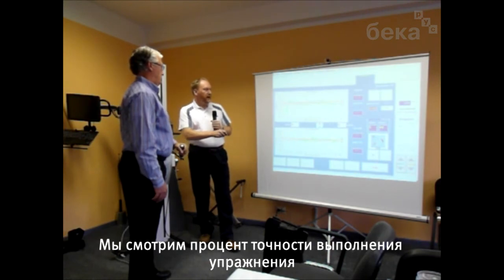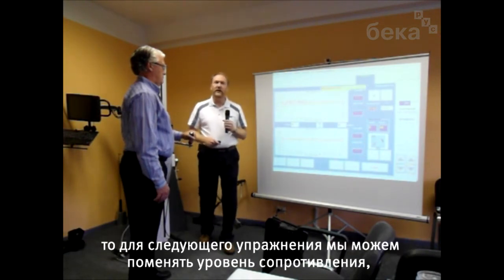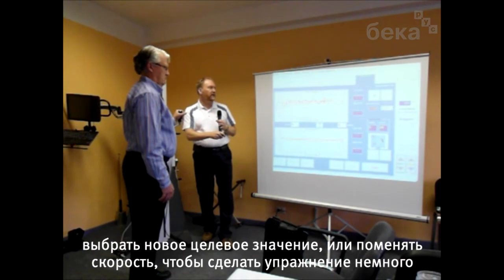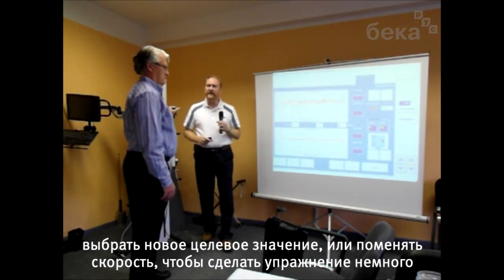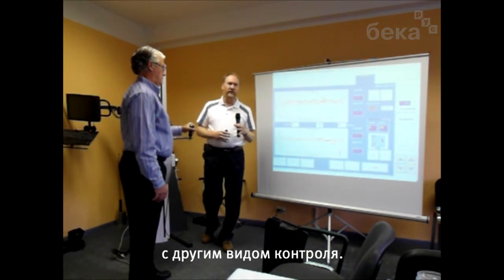So you'll monitor the percent on target, and again, once they achieve a percent accuracy of 50% or more, you can then re-challenge them with a new resistance, a new target, or change the speed for the next time to make it a different exercise, a different way of controlling.